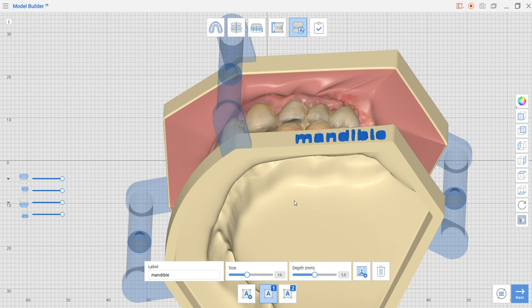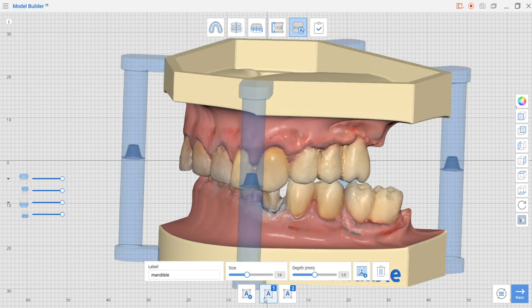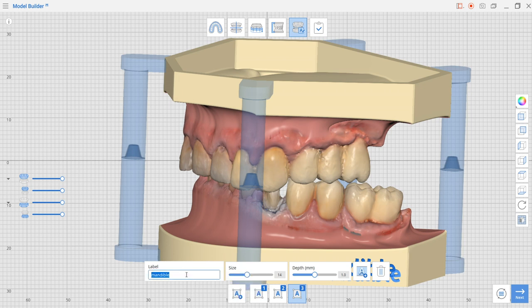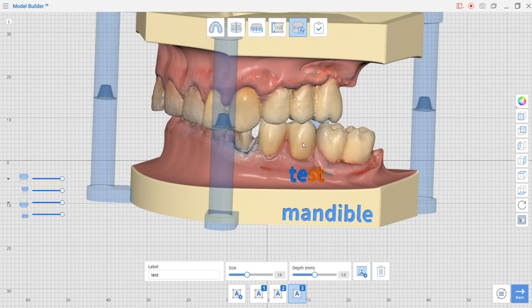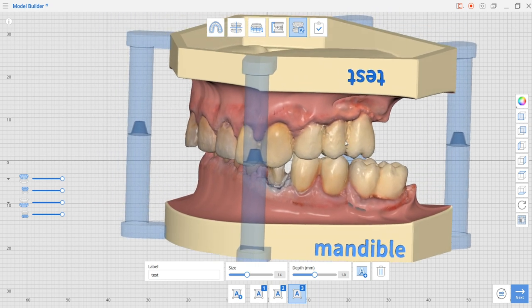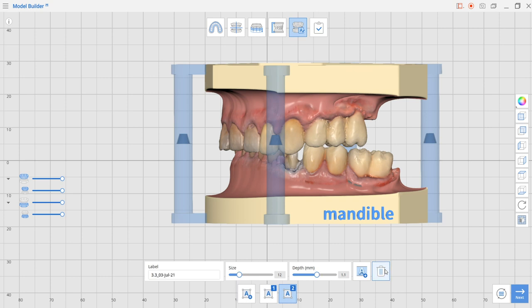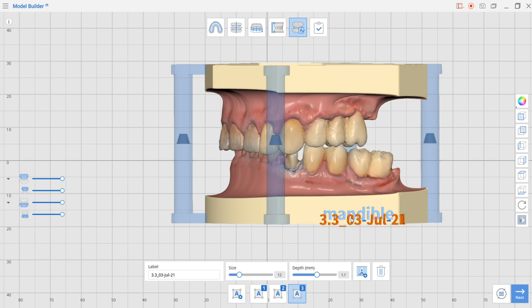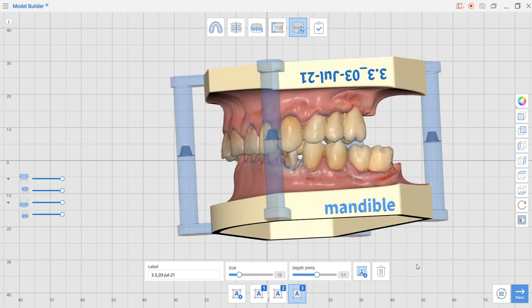We're going to add a new text and say test for example. We can drag it to the upper model. When it goes to the maxilla it gets flipped so it will stay in a perfect relationship to the base. We can also delete text by pressing the delete button.